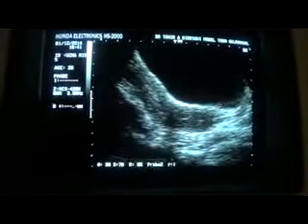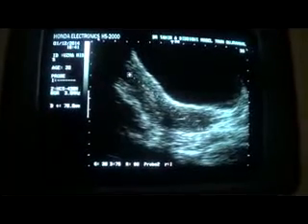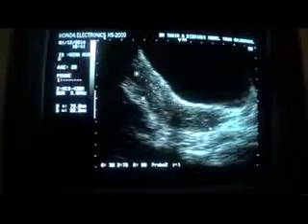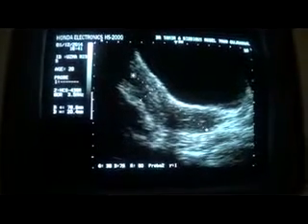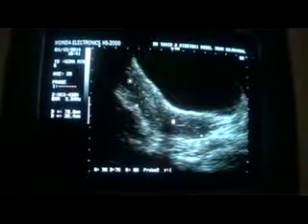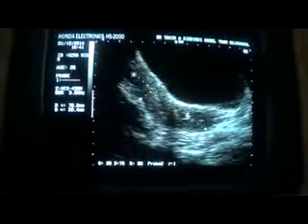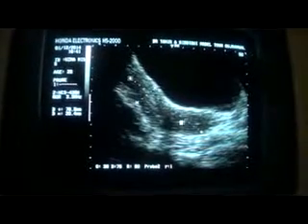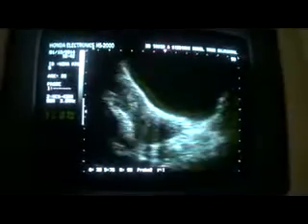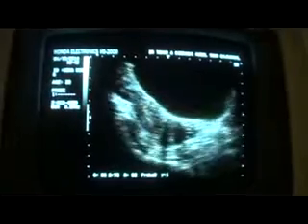If you measure this with the cervix, it is 7.8 by 2.20, so both of them are reduced in size in anterior-posterior diameter. The length is fine. This is the cervix and this is the endometrial canal. Sorry, I have taken both cervices together.